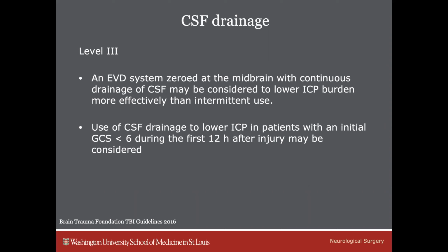So the guidelines say that an EVD system that is zeroed with continuous drainage of CSF is better than intermittent use. The concept of intermittent use is that you have an EVD and it's clamped, you're using it to monitor ICPs, and then you open it whenever you need to lower ICPs and then clamp it back again. Based on a review of several studies, the guidelines have said that it's better to do continuous drainage than use it intermittently.